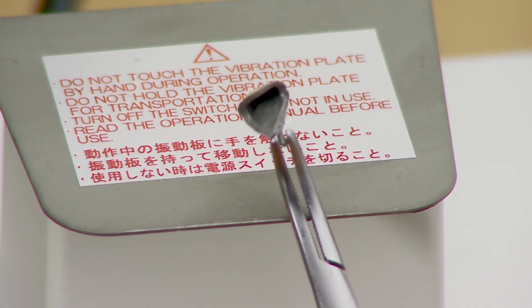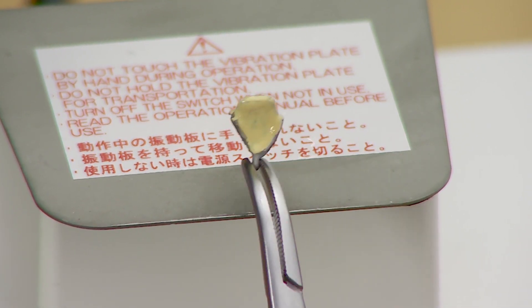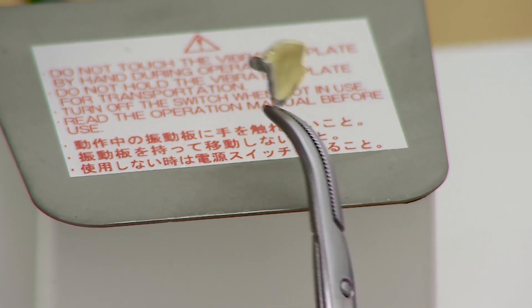Condense well with the Ceramic S condenser to ensure that the porcelain particles are densely packed, to enhance the bond and minimize firing shrinkage to less than 5%.